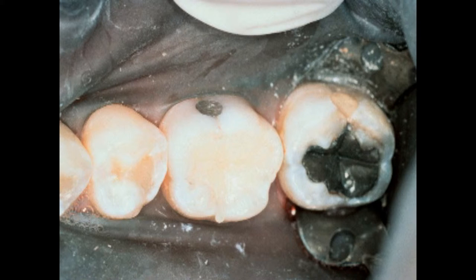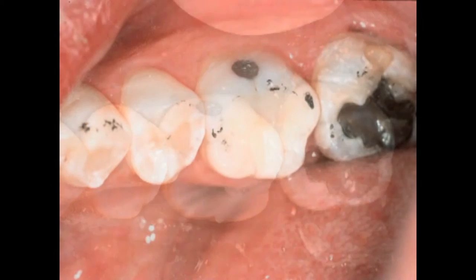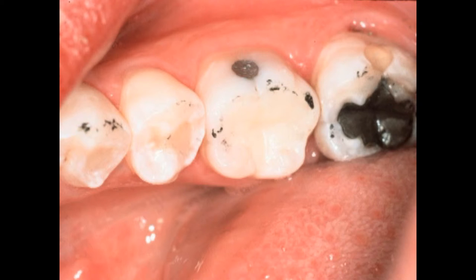This is untouched — you can see we have some flash here on the lingual, but the other margins need minimal if any finishing. The surface is hard and smooth since there was no air-inhibited layer, so consequently there's no polishing needed. Here's the final restoration: minimal finishing, no polishing, due to the clear custom matrix restricting oxygen from the surface. This saves the dentist and patient five to ten minutes of chair time.